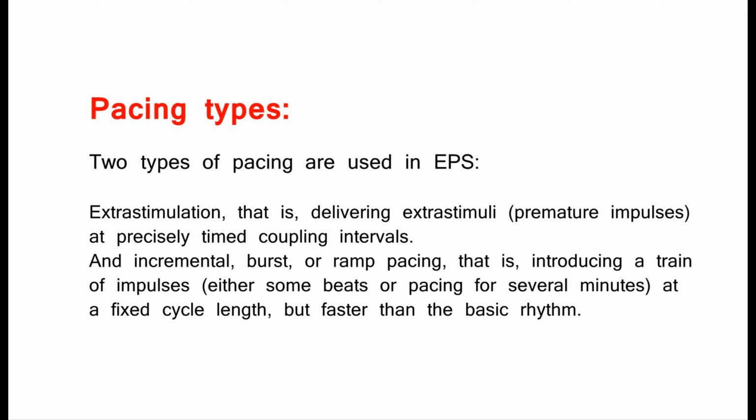Two types of pacing are used in EPS. Extra stimulation, that is, delivering extra stimuli, premature impulses, at precisely timed coupling intervals. And incremental, burst, or ramp pacing, that is, introducing a train of impulses, either some beats or pacing for several minutes, at a fixed cycle length, but faster than the basic rhythm.